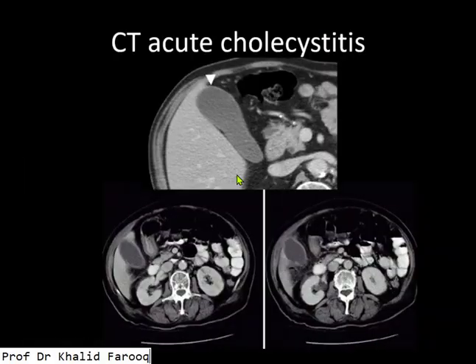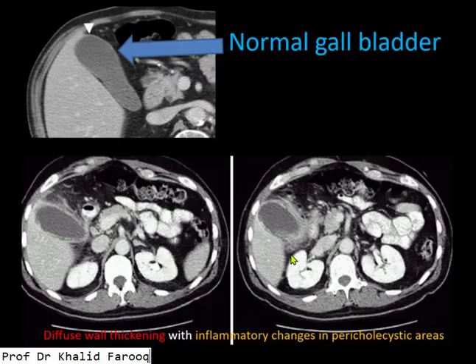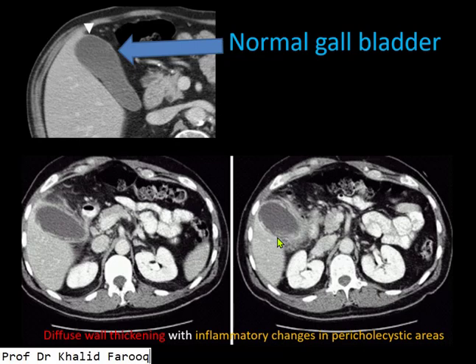Now we will discuss assessment of cholecystitis through CT scan. Again, this is a normal picture of the gallbladder on CT. Diffuse wall thickening is noted in these two images while inflammatory process is noted in the pericholecystic space, suggesting cholecystitis.